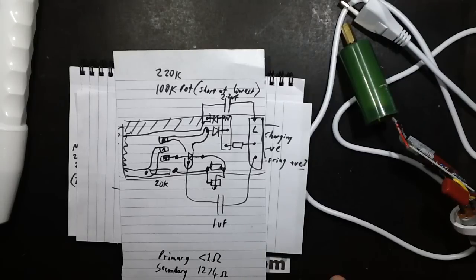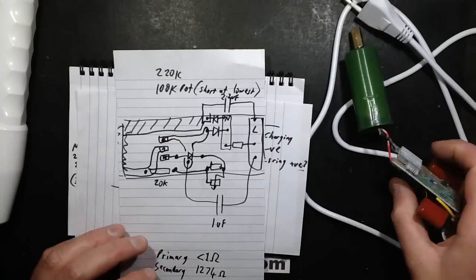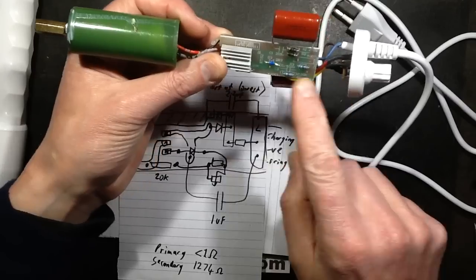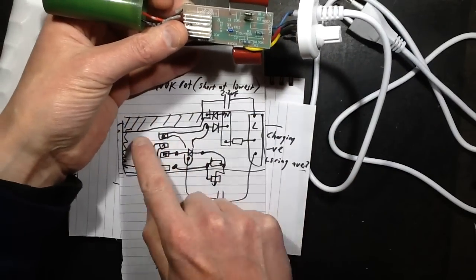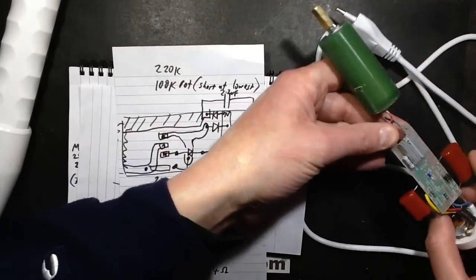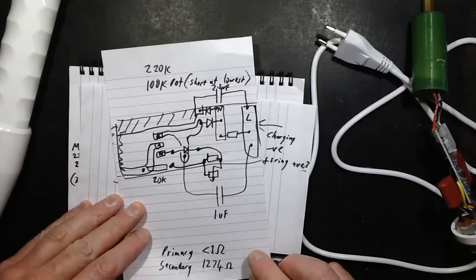Okay, well, that's it reverse engineered, and I have to say that was quite enjoyable. So, I basically just held this up to the light. It's a single-sided circuit board. I looked at the pads and tracks and just drew a silhouette of them and the components overlaid on top. Took some notes of the values.